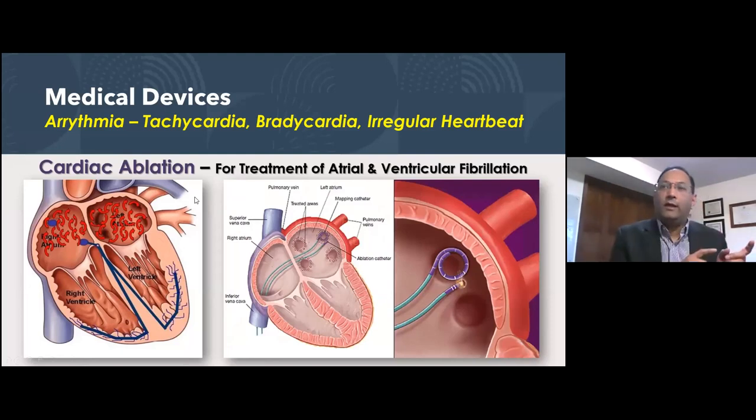So far with the pacemakers and defibrillators, you're managing the heart, you're managing the symptoms. You're not actually eliminating the basic issues. Cardiac ablation is where you attack the basic concerns. It is a treatment for atrial and ventricular fibrillation.